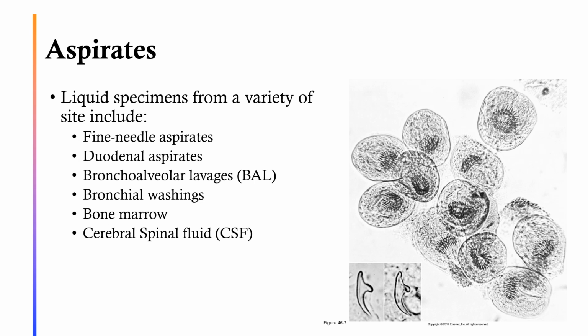So what you're seeing here in this image is actually an image of Echinococcus granulosus. This is an example of hydatid sand that was taken from an aspiration of cyst fluid. The cyst fluid can be found in the liver or lung, and we examine this aspirate for hydatid sand, or specifically looking for these types of hooklets.